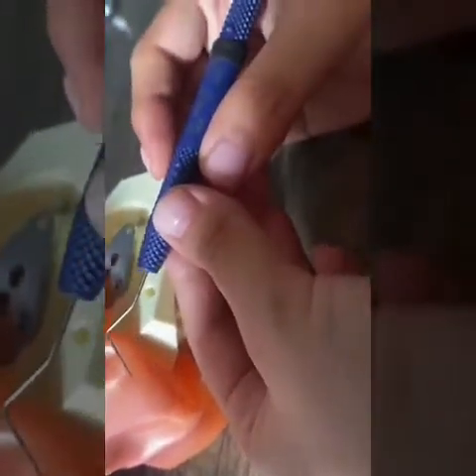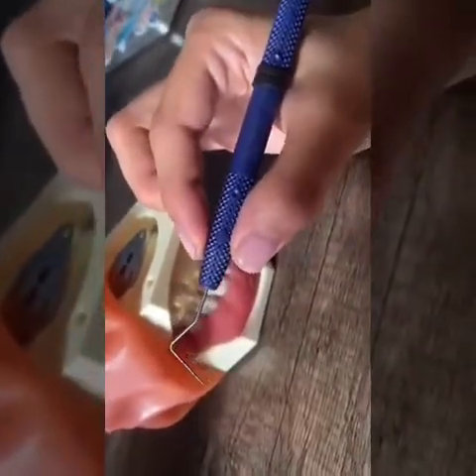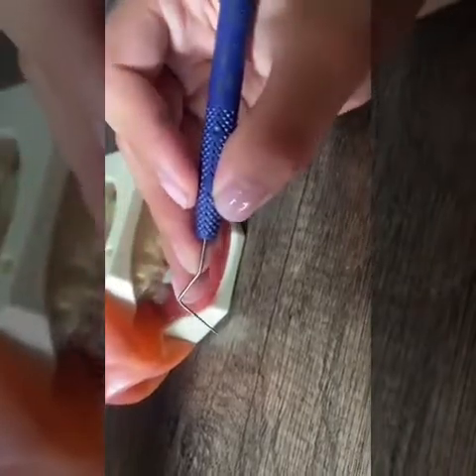To hold this instrument, you must use a modified pen grasp, which is your index finger and your thumb creating a soft C shape, just like this. The middle finger rests on the shank. The ring finger is going to be your fulcrum, resting on any tooth, and the little finger has no function at all, so it just stays tucked in, just like this.